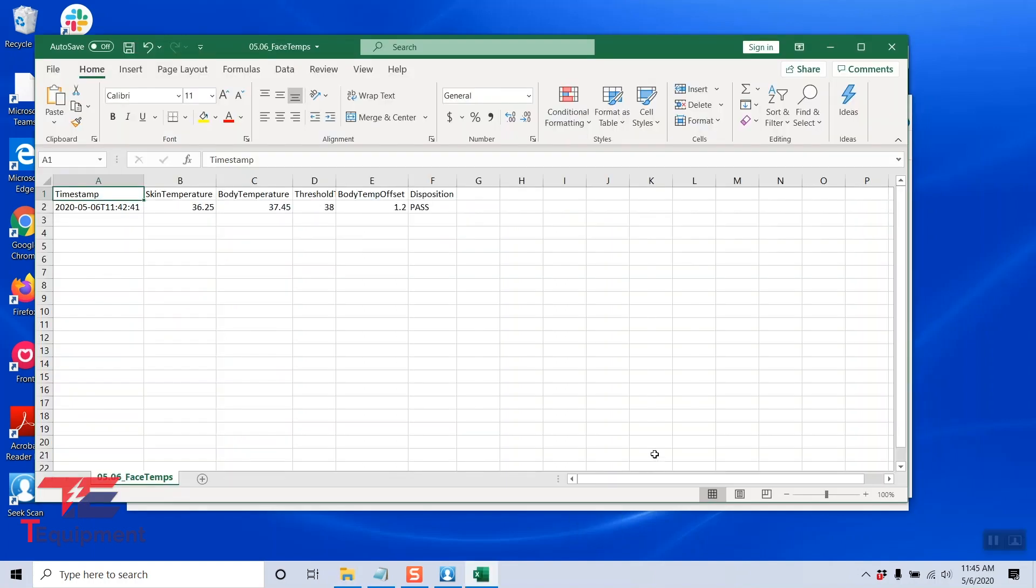And as you can see, it's a very simple file with a timestamp, the reading. So again, this was the original file we had with the Celsius and the current pass or fail.